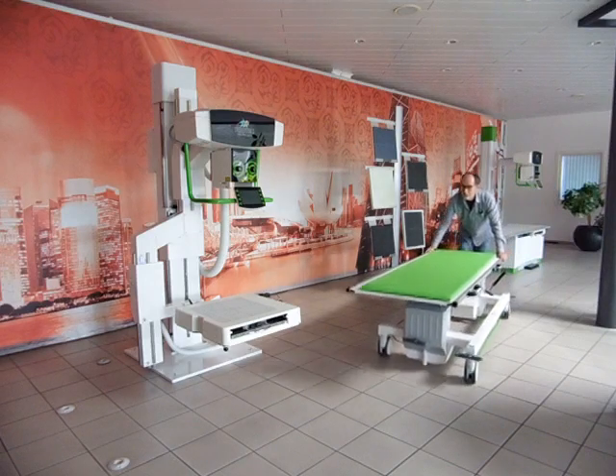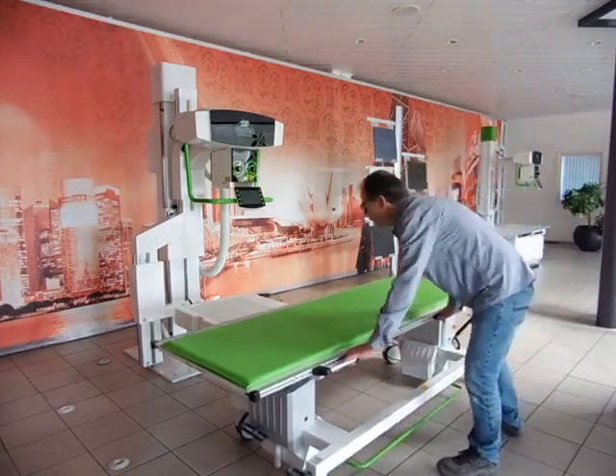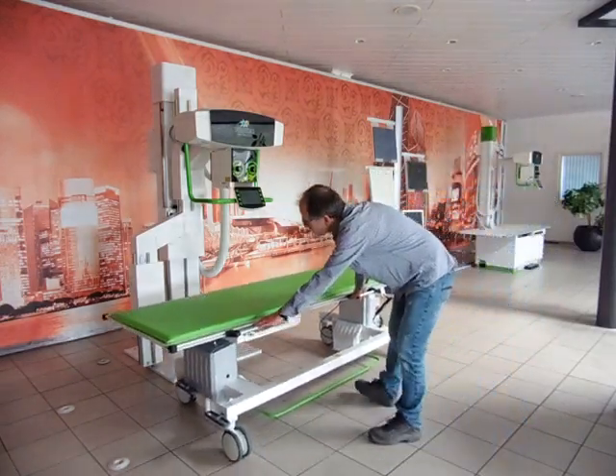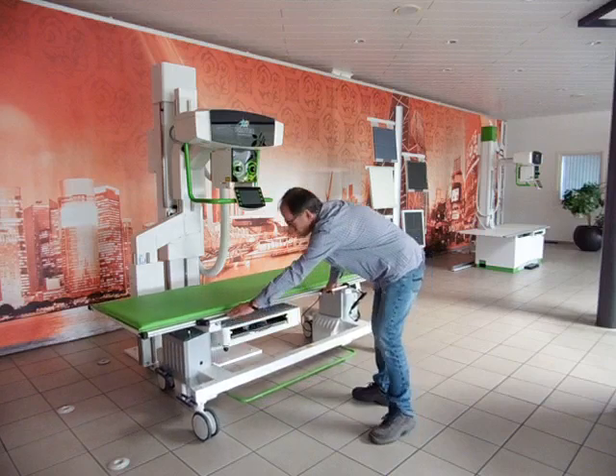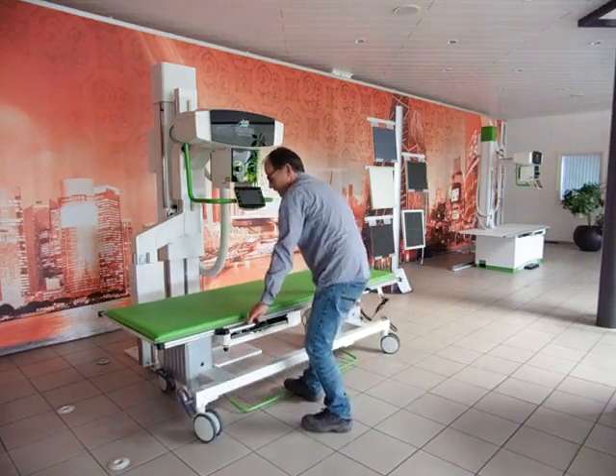The moveable table can be easily positioned over the bucky, and the patient can lay down before or afterwards, as will be shown here in our case.